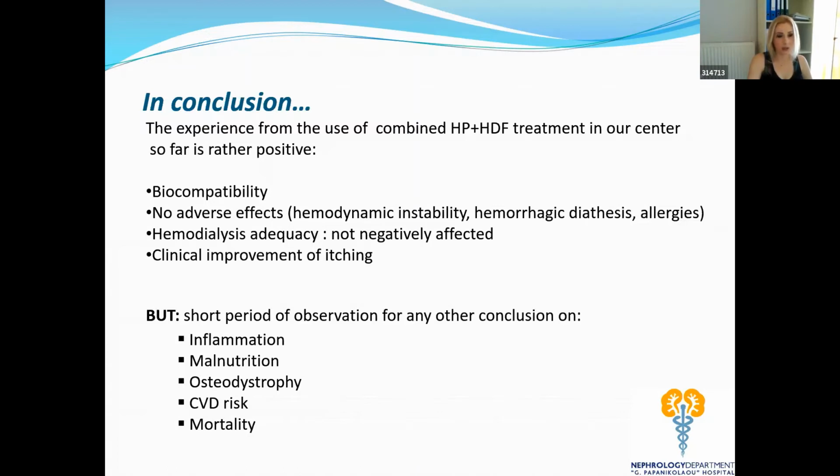Hemodialysis adequacy, plasma protein, liver function, and blood cell count were not negatively affected. But I have to remind you of the short period of observation that prevents us from drawing any safer conclusion. And this combined novel treatment strategy aims to achieve a long-term improvement in patient survival and quality of life. Thank you.